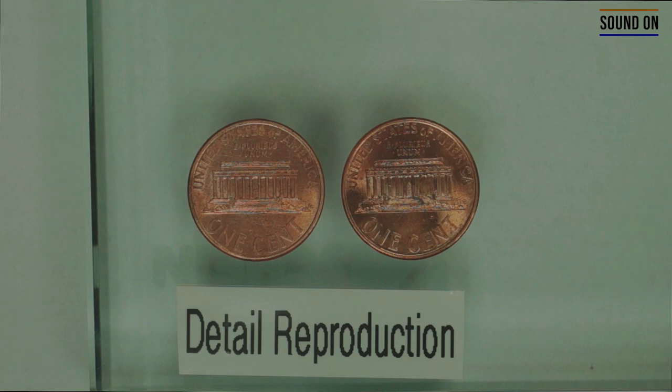We're going to train using two different impression materials. On the coin on the left side, we're going to use the light body PVS. On the coin on the right side, we're going to use the polyether in the light body consistency. The goal here is to copy the outline of the body in the Abraham Lincoln Memorial area, using both materials.